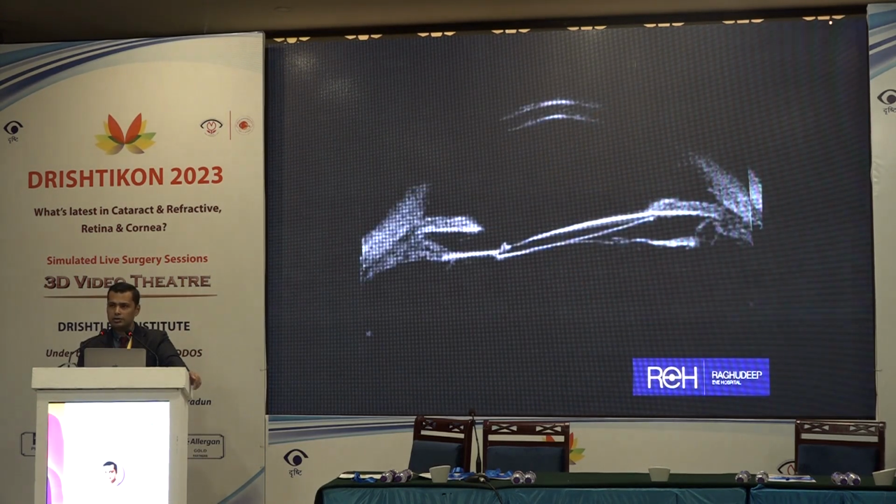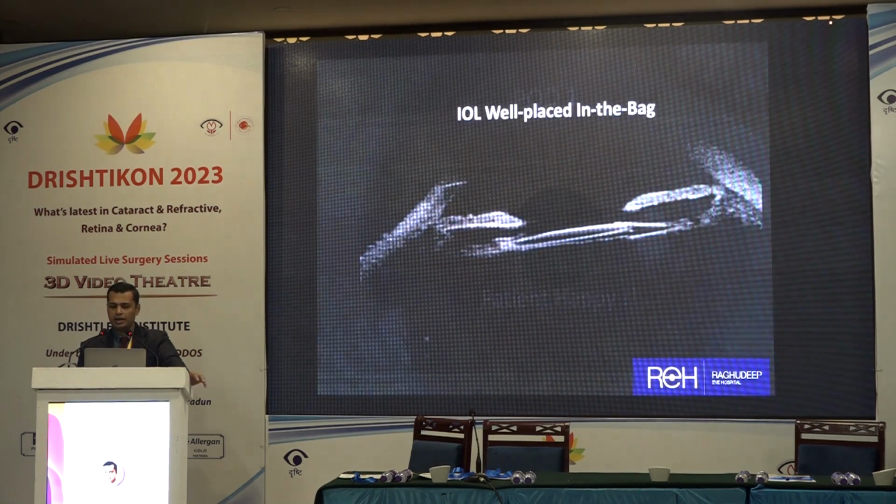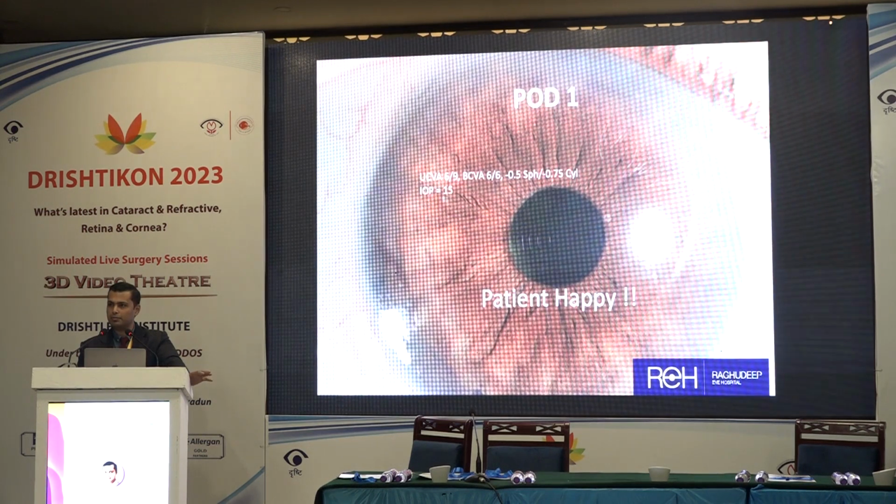All we had to do was dissect out this lens and push it from the sulcus right into the capsular bag, and that solved the problem for us, and the patient was happy. So it was not a problem of the lens, it was the problem of the surgery, and we picked it up. We would have thought, kya farak pad raha hai, adha rakha hua hai, the lens is the problem, but that's not the case. When we look at it from an optical point of view, we do realize that all these things will matter, but sometimes the only way to see it is using these machines.